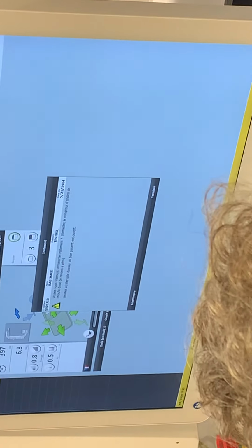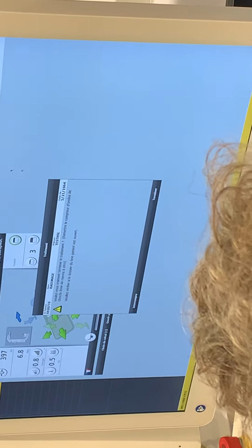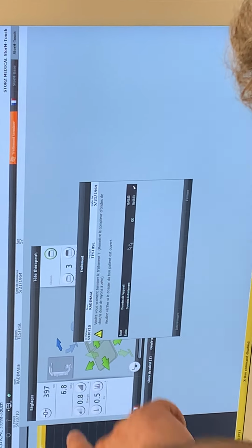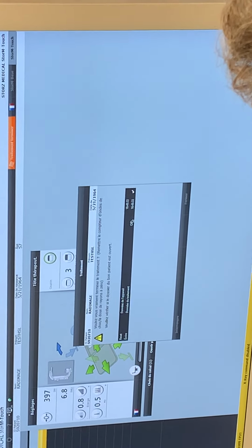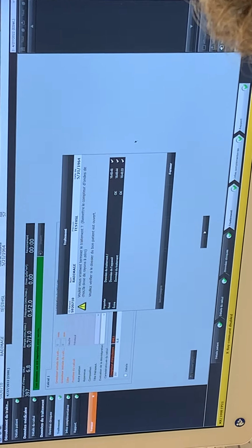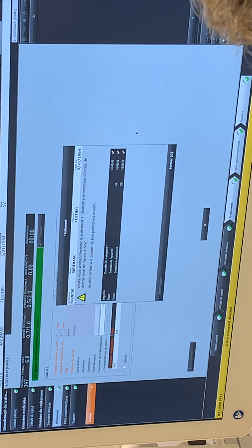Verify that the patient is open and so on, and that's where you need to check that the control panel is unlocked. This is very important for you. If you're doing an ultrasound case outside and you want to finish the treatment here inside, you need to unlock the control panel before you press on finish treatment.